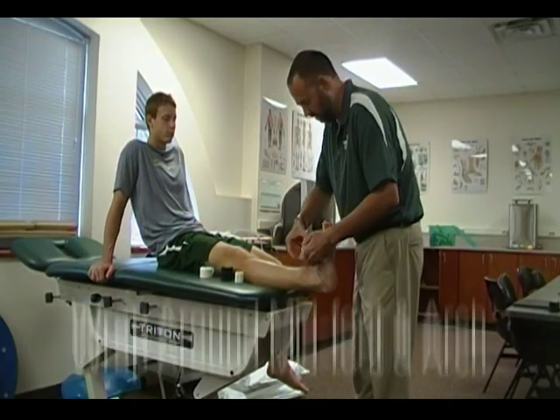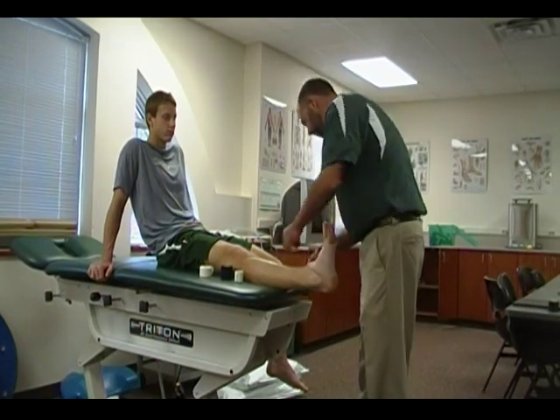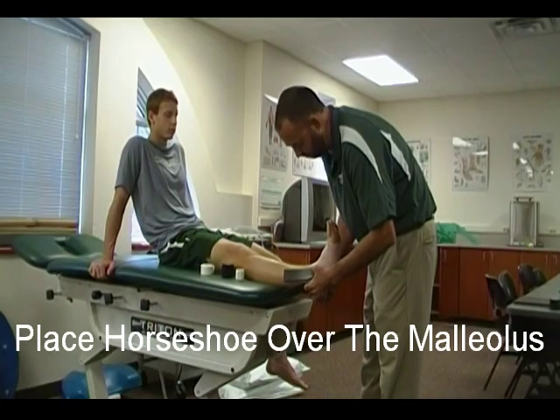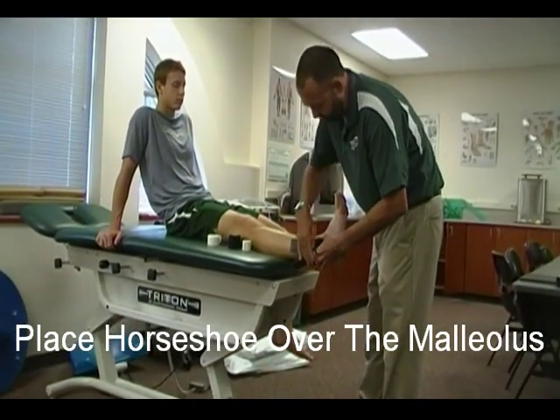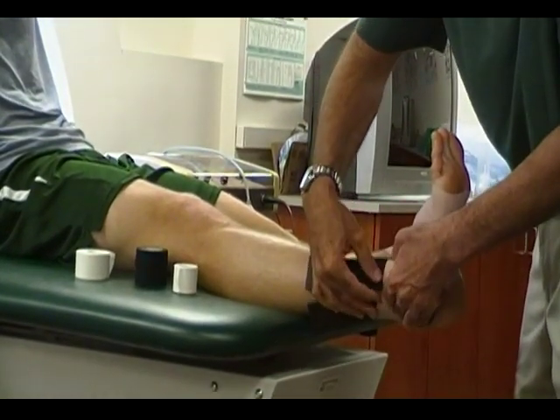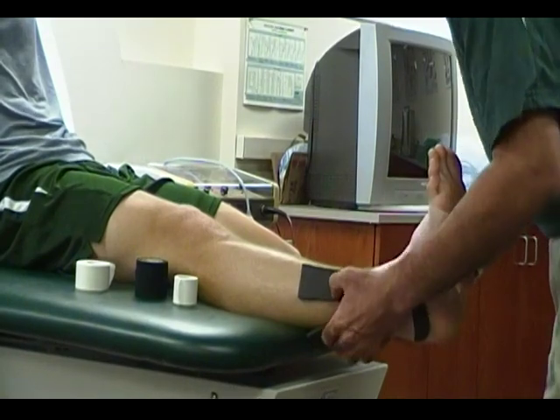Lock in around the mid-foot in the arch. Place our horseshoe over the malleolus. This will allow the swelling to be minimized right here, where it oftentimes will collect, and it will help push the swelling up into the lower leg.